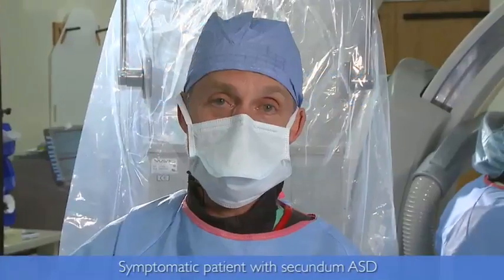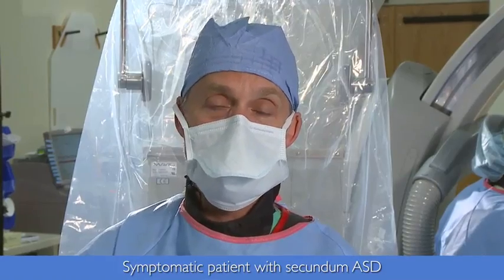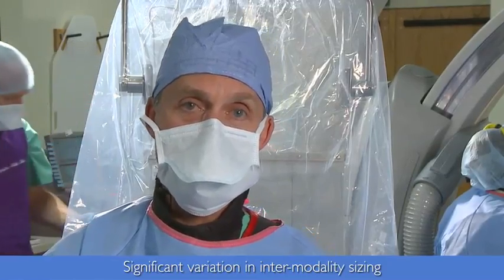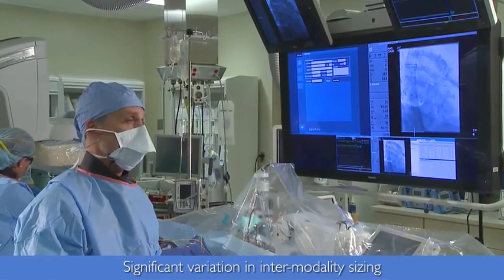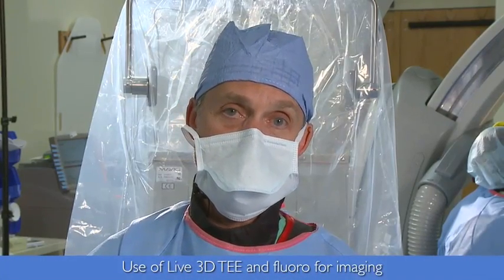This is a 72-year-old woman who has a symptomatic atrial septal defect of the secundum variety that has been sized anywhere in the low teens to the mid-20s by a variety of imaging modalities. Today we're going to close the defect. We're going to use image guidance that's both traditional fluoroscopy but also using echocardiography, specifically real-time 3D TEE with its accompanying X-plane, two simultaneous ultrasound perspectives.